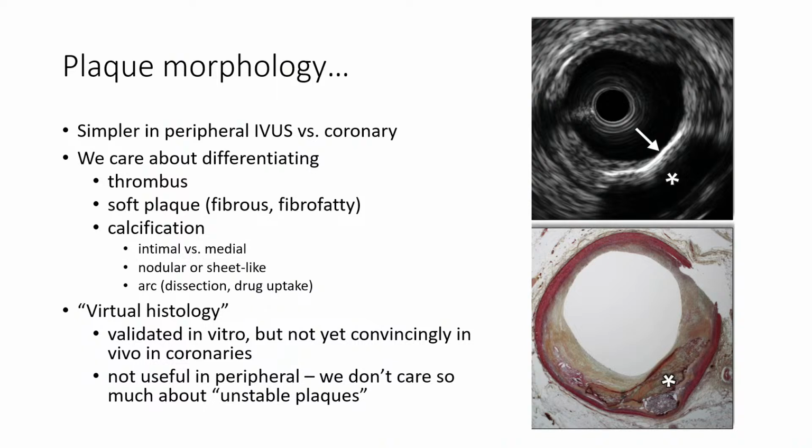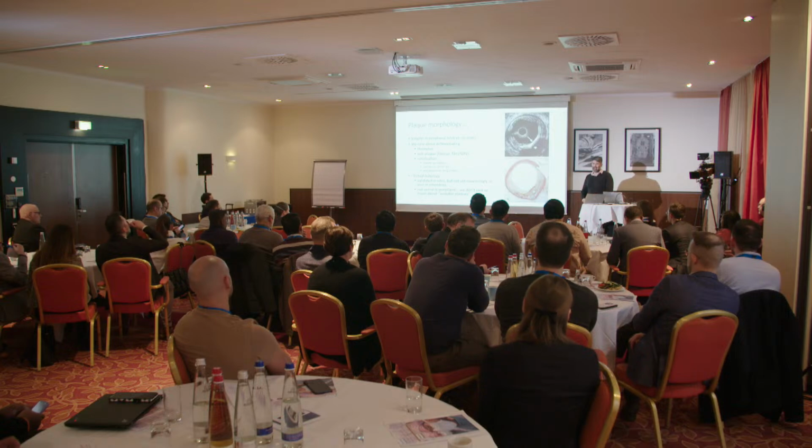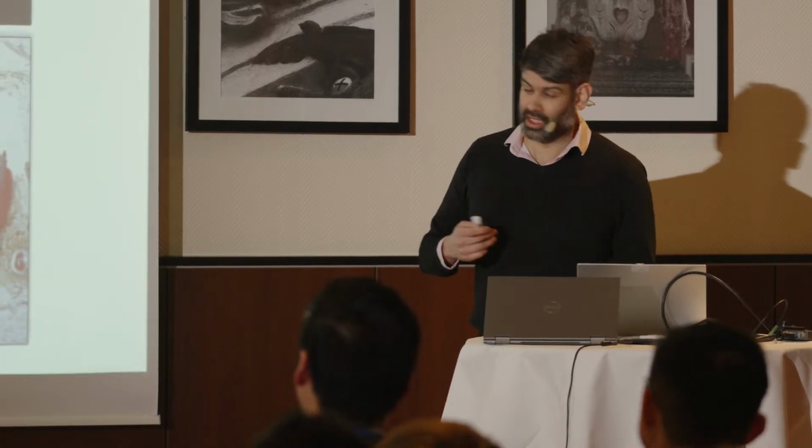And for me, as a radiologist, I don't have the benefit of years of experience of holding these arteries in my hand. So for me, IVUS is like the cheat code, which tells me what I should expect to feel if I was holding that artery in my hand without actually having to get the artery out and putting it between my fingers. And that's where IVUS has made a huge game changer for me personally.